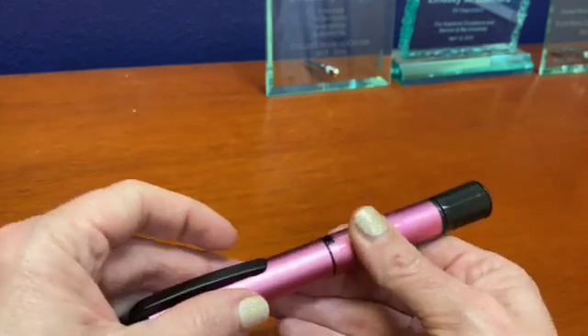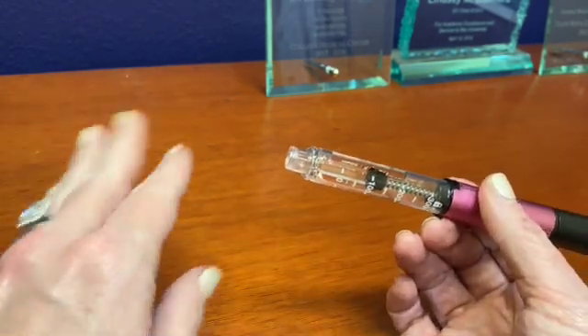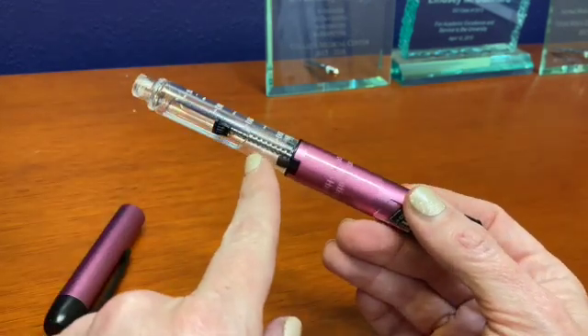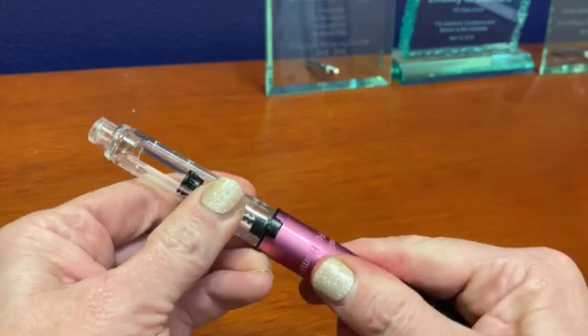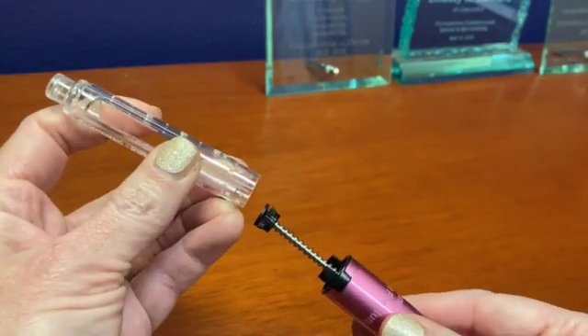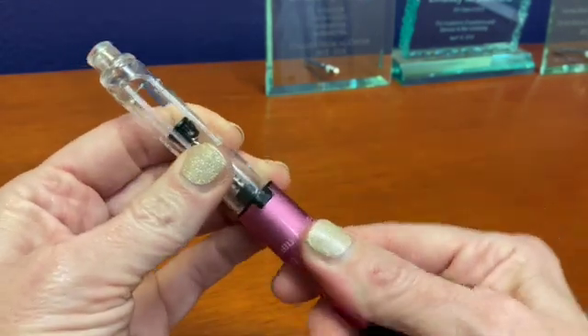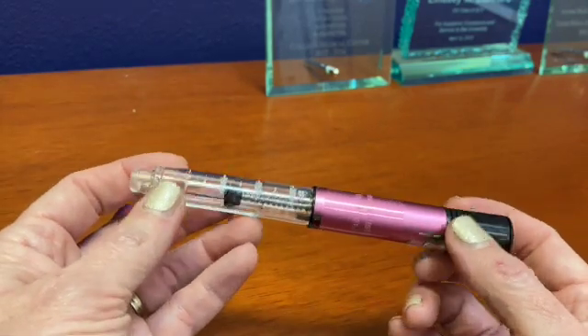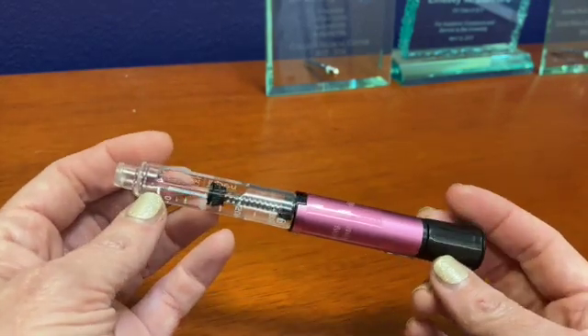Instead of ordering insulin pens or vials like we had done in the past, we order the Novolog or Humalog in cartridges, and those cartridges fit inside this holder here. It's the same size as an insulin pen, and you get 300 units of Novolog or Humalog in it.